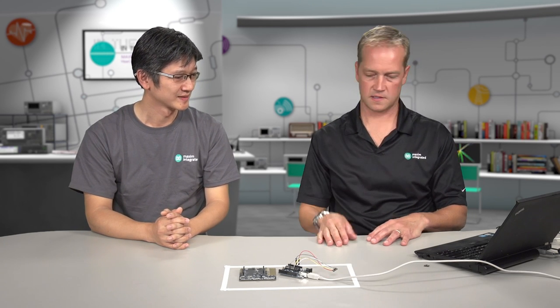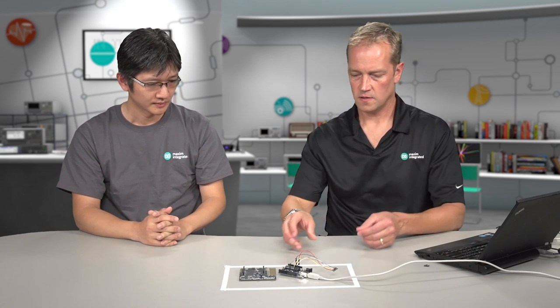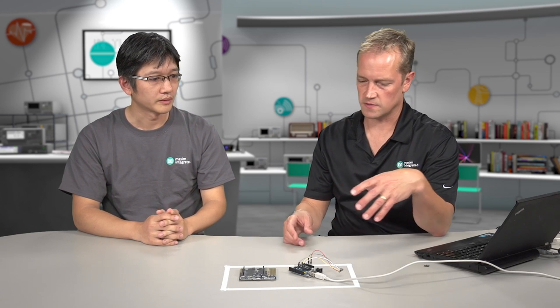Okay, awesome. Well, let's go ahead and stop doing that guy and migrate over to the mbed platform and see how that guy works. Does that sound good? Yes. Okay, awesome. Gordon, as I'm moving over and wiring it up, can you comment on the DC to DC power supply and the level translator?